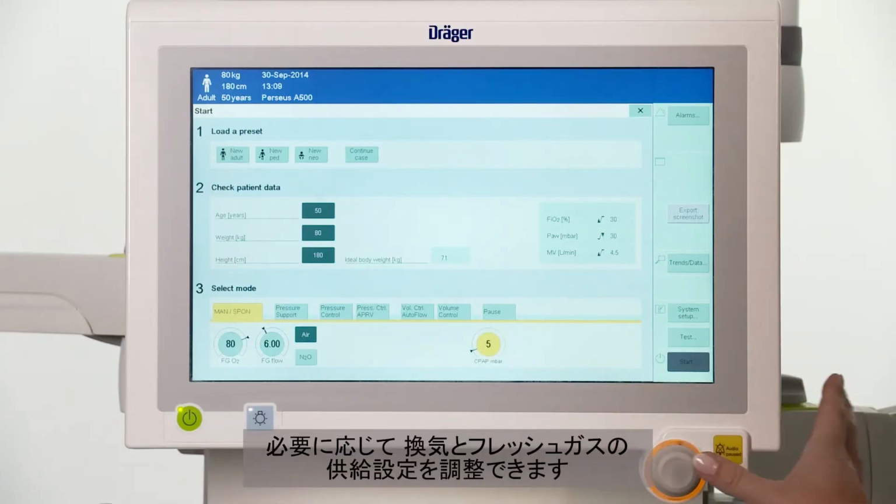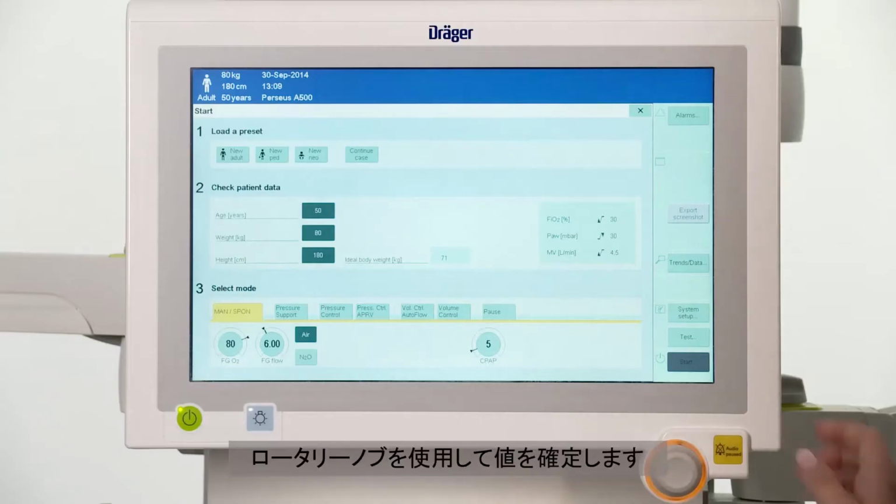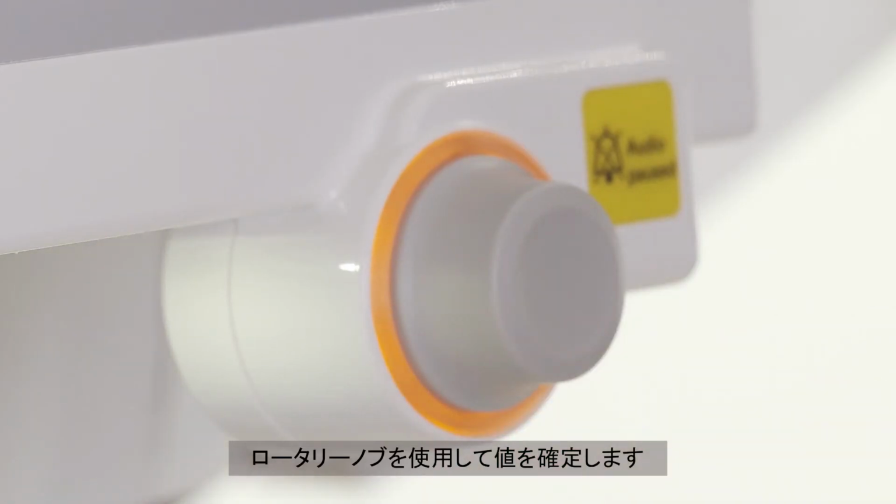If necessary, you can adjust ventilation and fresh gas delivery settings. Use the rotary knob to confirm your settings.